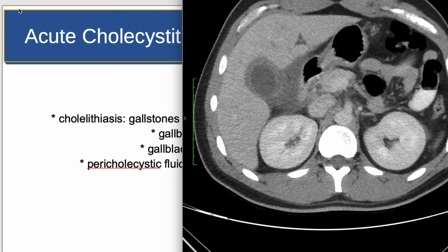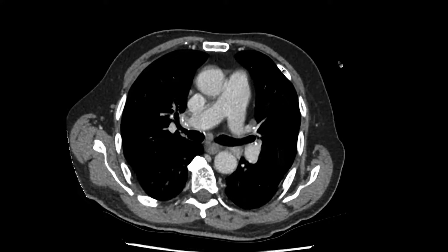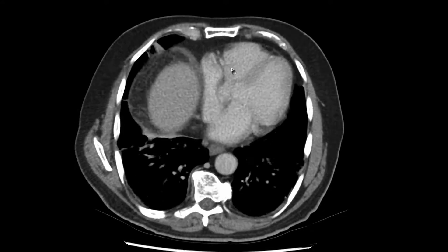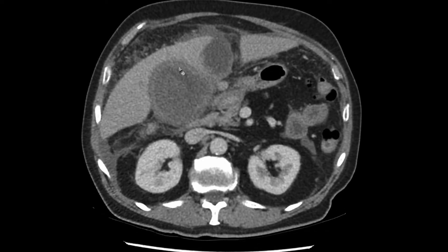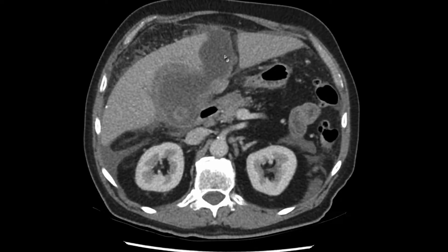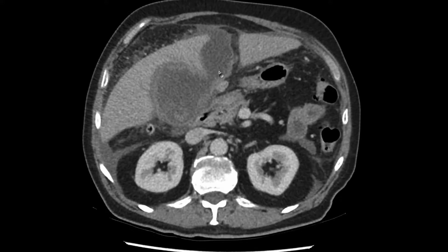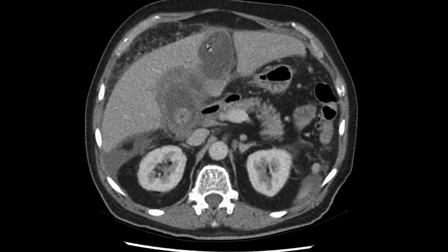Our next case demonstrates a complication of acute cholecystitis. This is a CT scan of the abdomen in a 74-year-old patient with right upper quadrant pain. Scrolling down, we can see the gallbladder is distended with thick walls containing a gallstone and pericholecystic stranding, indicating acute cholecystitis. On the left anterolateral aspect of the gallbladder, there is a lobulated fluid-density collection in segment four of the liver. There is a fistulous communication between the fluid collection and the gallbladder, and in this region the gallbladder wall is indistinct. This indicates that the gallbladder has in fact ruptured, resulting in a contained perforation and abscess within the liver.